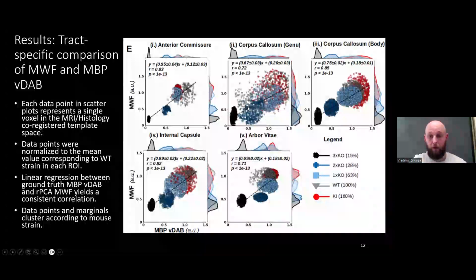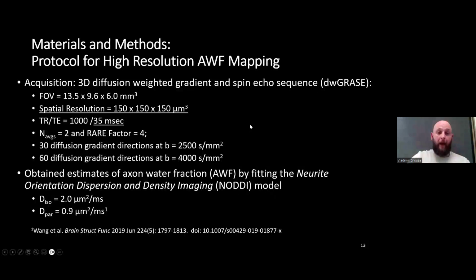So that's further encouraging. When we're trying to do this myelin water imaging technique, which essentially tries to split the protons that reside in these intralamellar spaces and therefore have this characteristic short spin relaxation time, we can see that what we quantify, the myelin basic protein itself, is also linearly related. So that's also encouraging. And we decided to also complement all of this with a diffusion study.